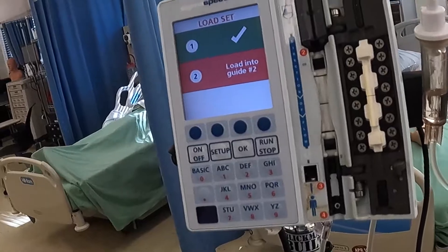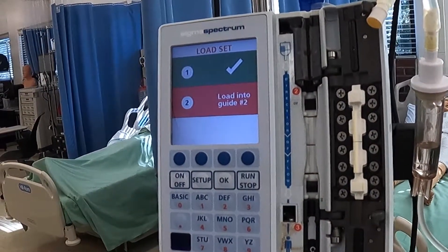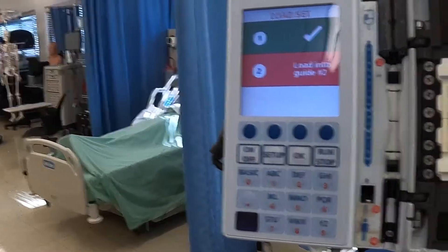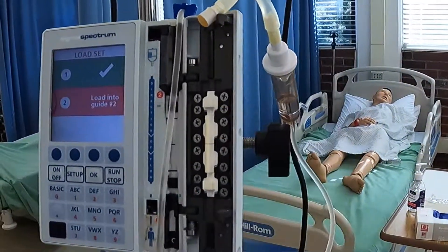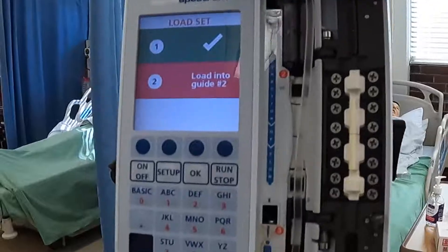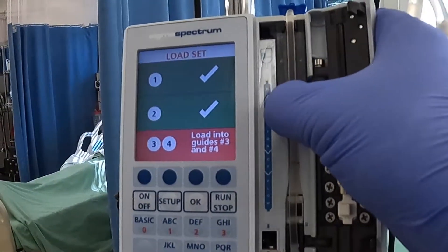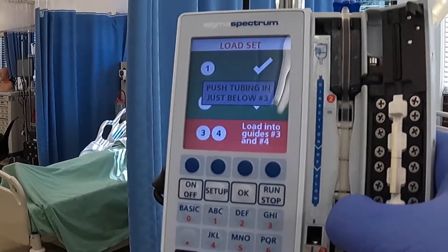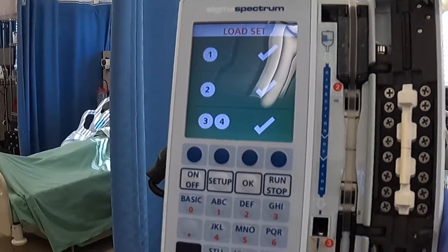As you can see on the screen, it says number one, the load set check, and number two hasn't happened yet. So what you're going to do is take your tubing and fit it right in this little groove. Bring your fingers down, and as you're doing it correctly, it's going to tell you so on the screen. You have to hit all the points — three and four.